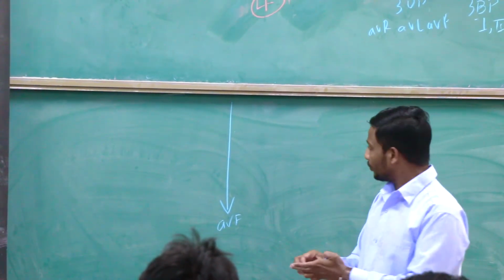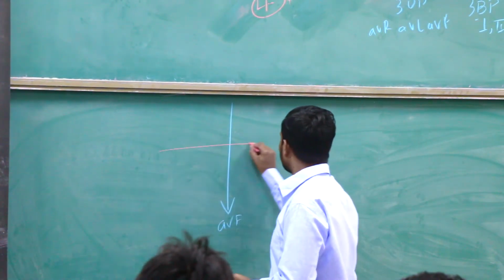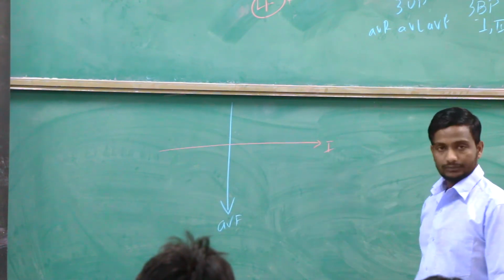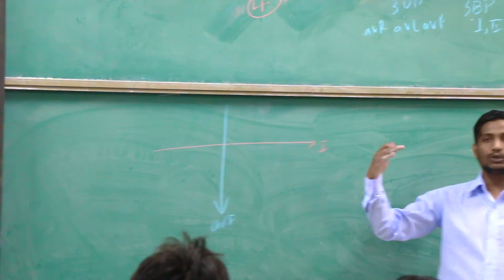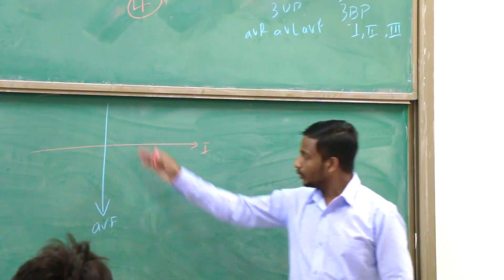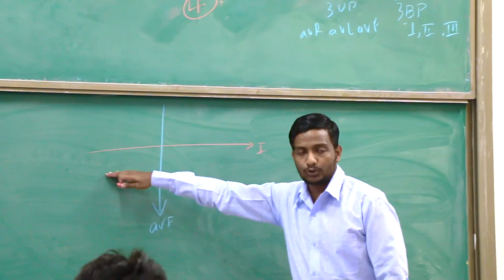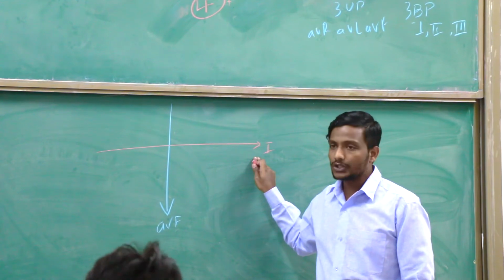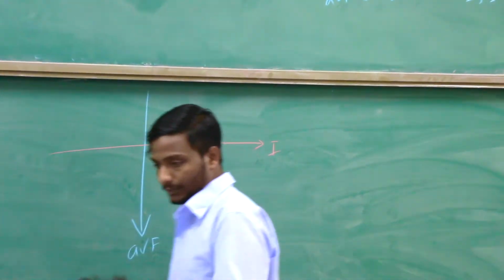The second lead I am going to put here is going to go from the right arm to the left arm. Can you guess which one I am talking about? Lead 1. Right? So I am going to put the unipolars and bipolars together. I am going to make one hexaxial system. So I put AVF in the y-axis, I put lead 1 in the x-axis. Any concerns now?